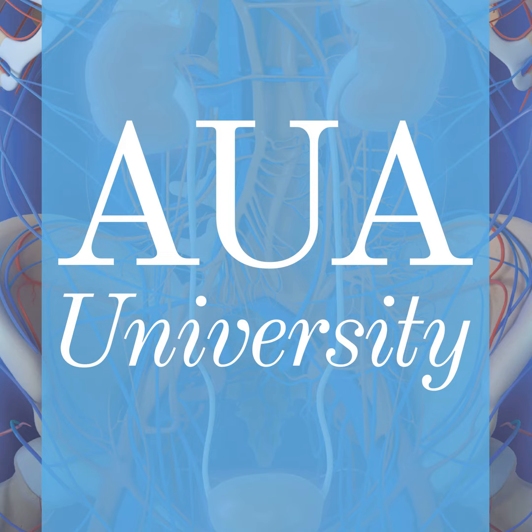Again, underlying the value of perhaps getting a PET scan prior to initiation of salvage radiation therapy. And here you can just see this survival curve and freedom from progression. Again, if they had a negative PSMA scan or showing fossa disease only versus outside the fossa.